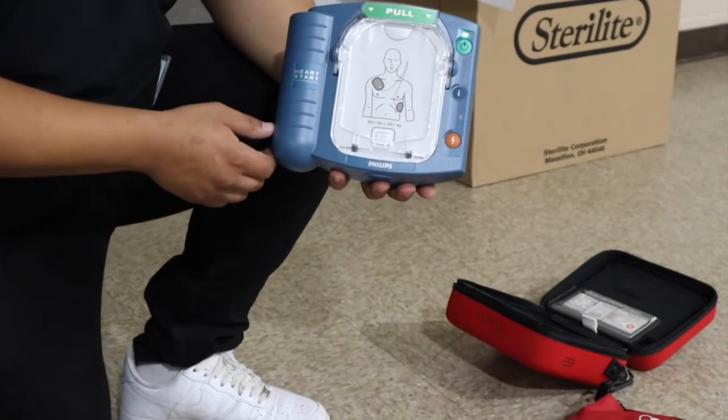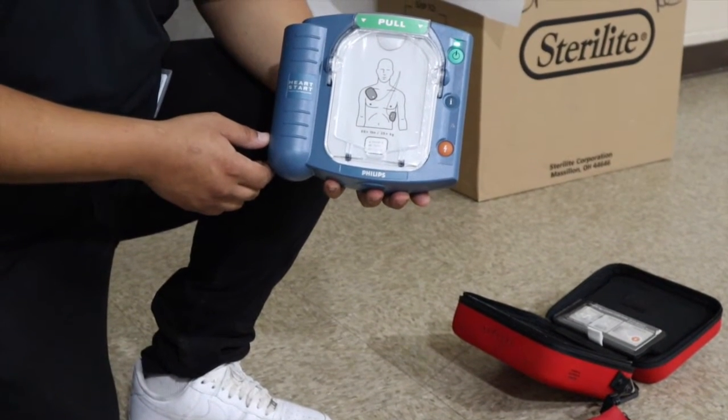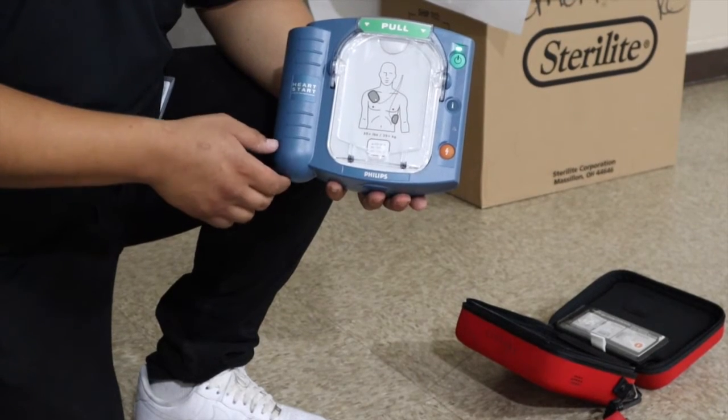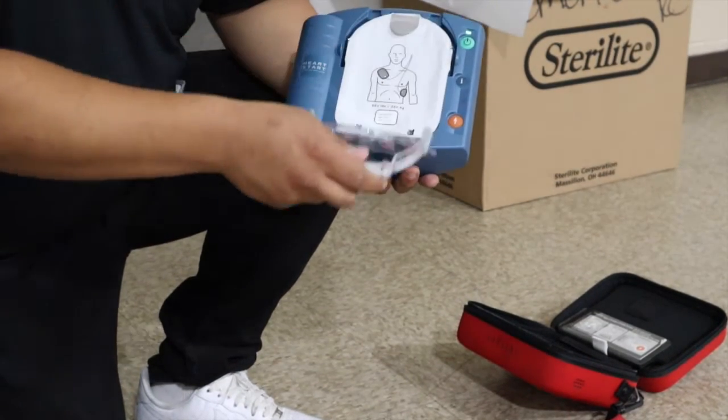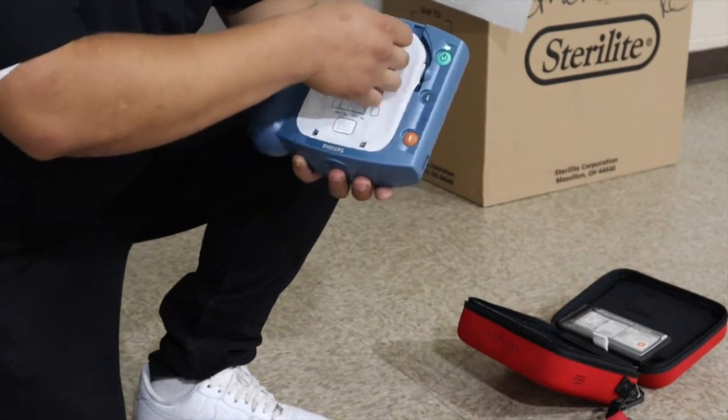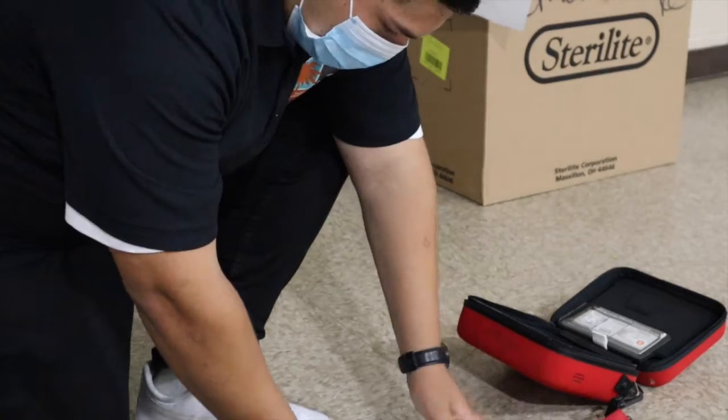When the patient's chest is bare, remove the protective cover and take out the white adhesive pads. So now we're going to remove the cover and take out the white adhesive pads.